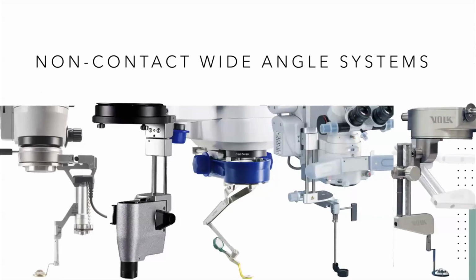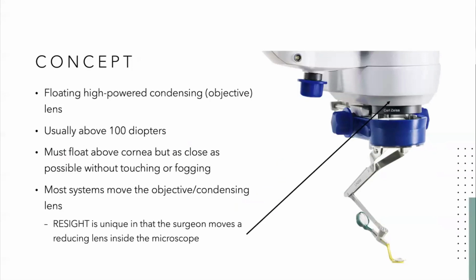And these are some of them. On the left, that would be a Biome system. And then in the center, that's the ReSight system that I use. On the very right is that Volk Merlin system. Just a few of the ones. Why I use the ReSight, I just want to touch on it quickly, is I think it's got a clever way about how to control the angle of view compared to the other systems.